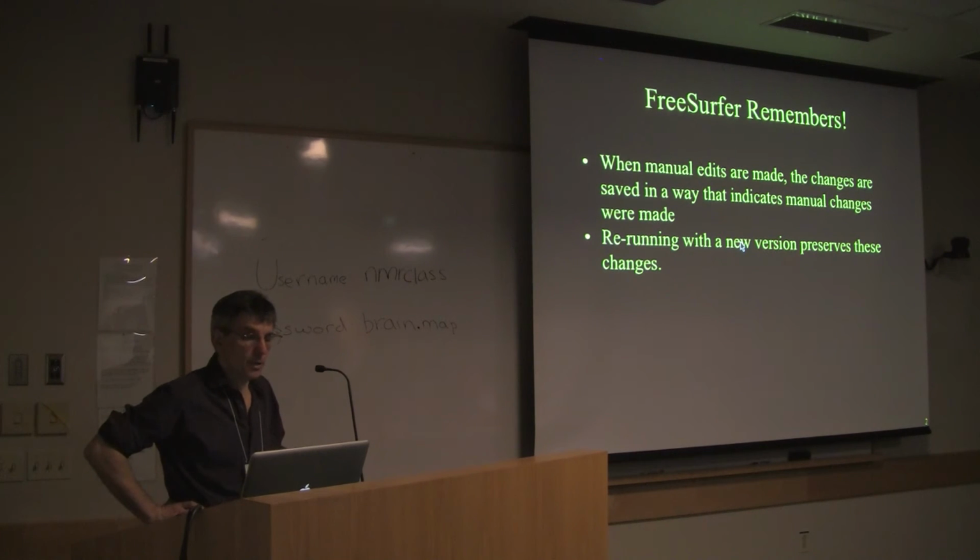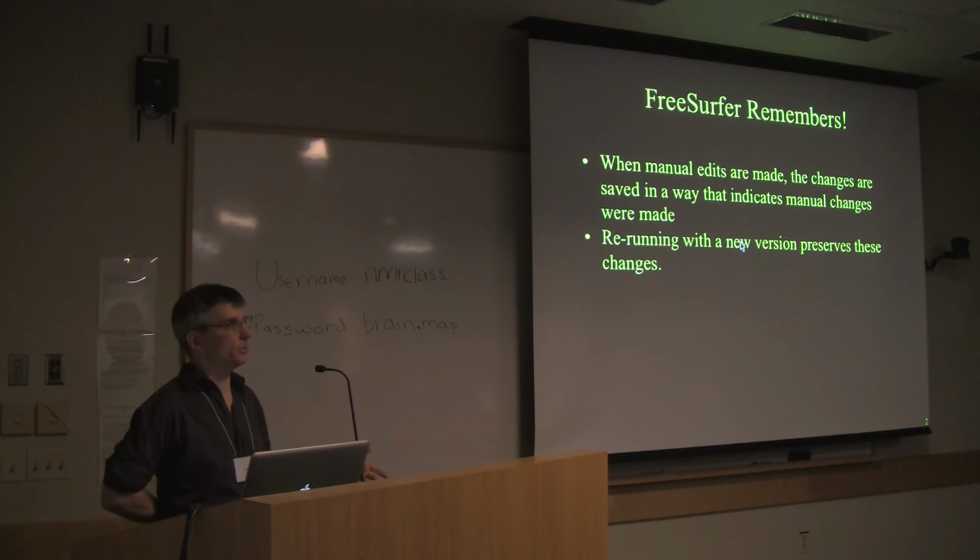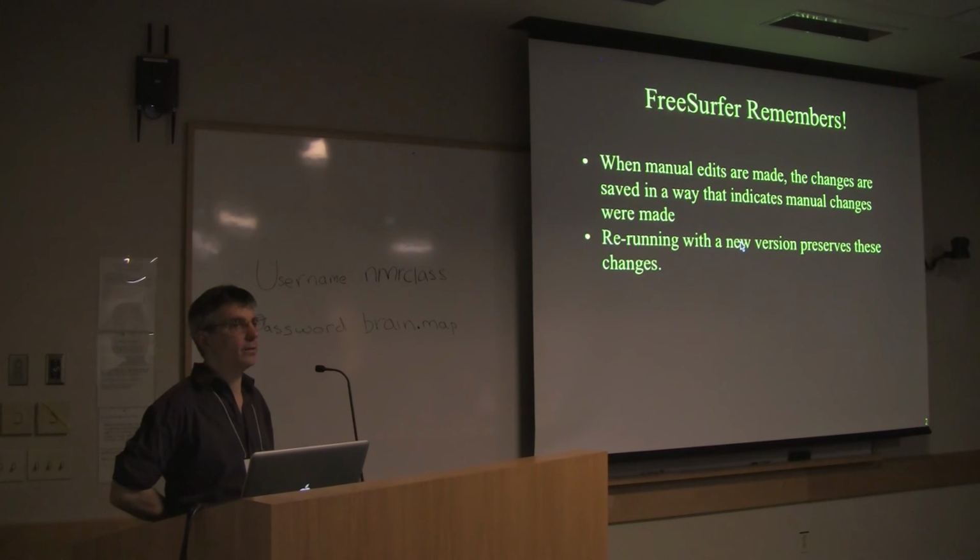FreeSurfer remembers. So when you make manual edits, it will save those in the FreeSurfer directory. And if you were to rerun with a new version, FreeSurfer would preserve these changes. So this is nice because occasionally you want to just reanalyze all of your data, and it is a little bit tedious to go through all of your subjects, and you want to make sure that your edits are preserved. So unless you tell FreeSurfer to delete an edit, it will keep an edit there the whole time.